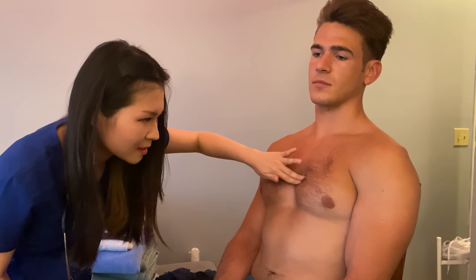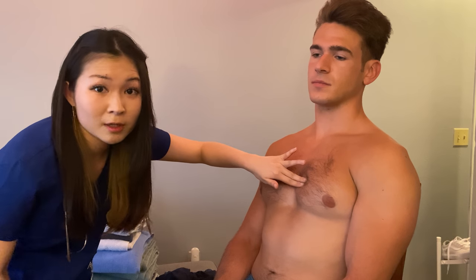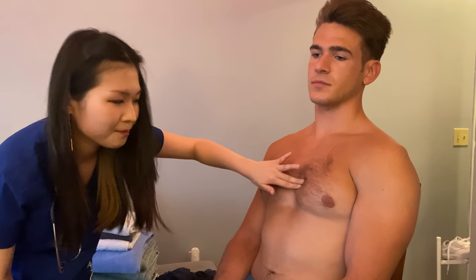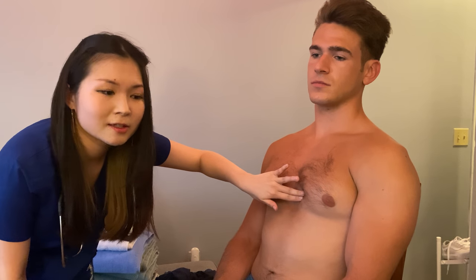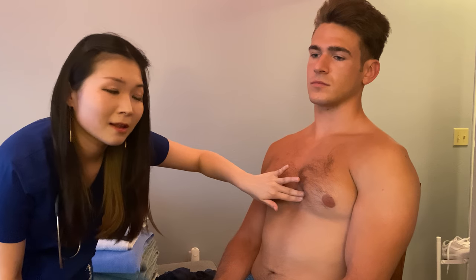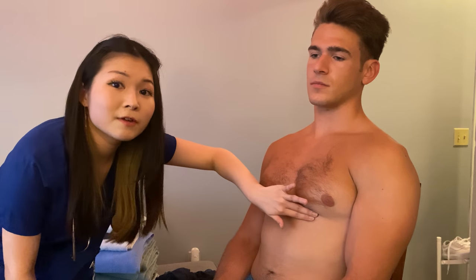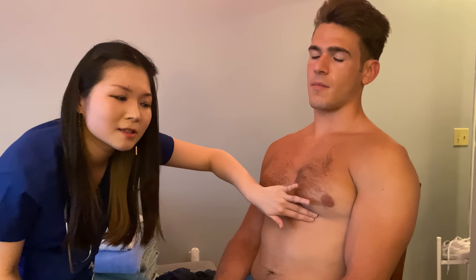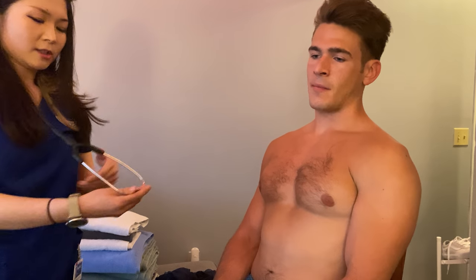I'm going to move one rib space down. That is Erb's point, and that is usually where heart murmurs are found — this is the third intercostal area in the left sternal border. Moving one more down, this is the fourth intercostal area, the tricuspid area, also in the left sternal border. And lastly, the fifth intercostal space on the left, in the midclavicular region — this is going to be the mitral area. Now I'm going to auscultate in all of these areas.